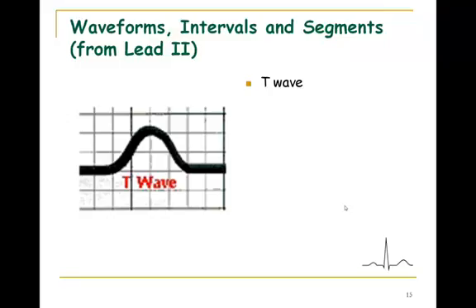Well, the T wave does not follow the rules that we said, that if the average current flowing is running towards a positive recording electrode, it is an upward deflection. Here, I should have said that it's really the wave of depolarization running towards the positive recording electrode that gives an upward deflection. The rules of repolarization are different.